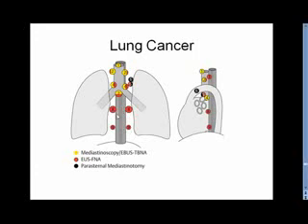We can also frequently obtain hilar lymph nodes, especially those located on the right side, on the left side, and we can obtain samples from the aortopulmonary window lymph nodes, which is area 5.